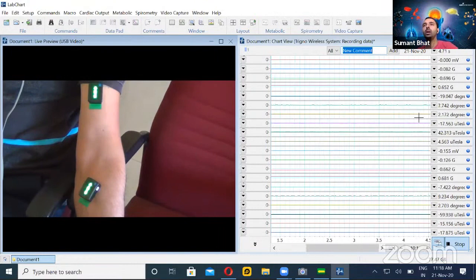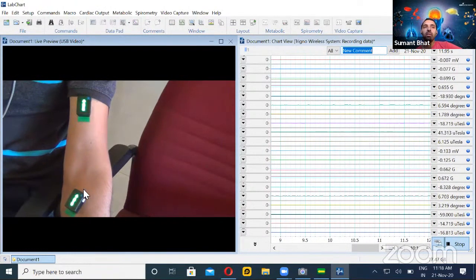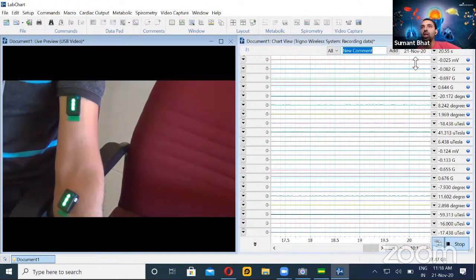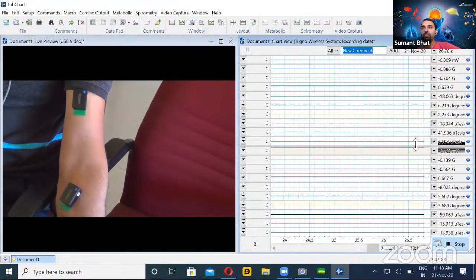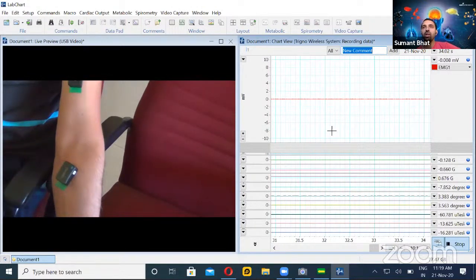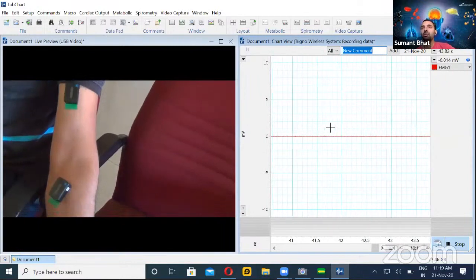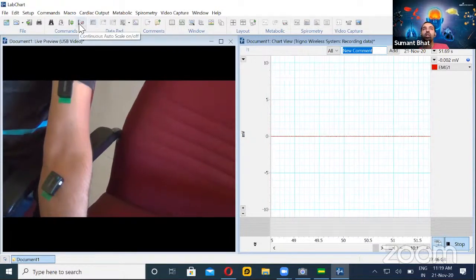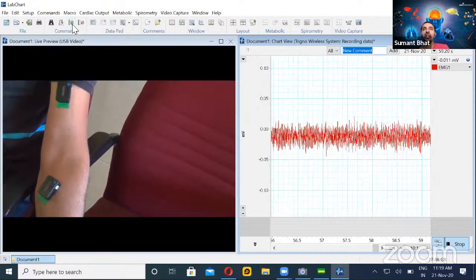I hope you are able to see some data coming in — the sampling is happening. But since there are many channels, roughly about 10 signals from each sensor, we have a very narrow channel height. I will maximize the channel height by clicking and dragging from the divider so that I can visualize the first channel properly. Once we get the signal but can't visualize it properly, the first action is to scale up. You can see there are icons which will help us to scale automatically.